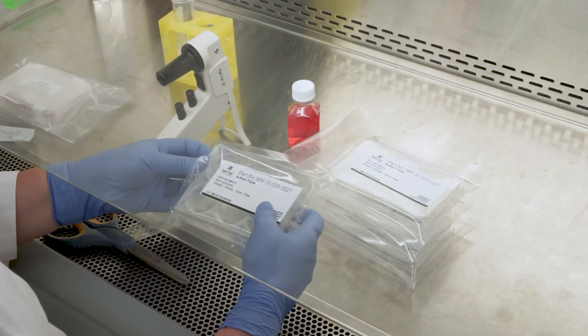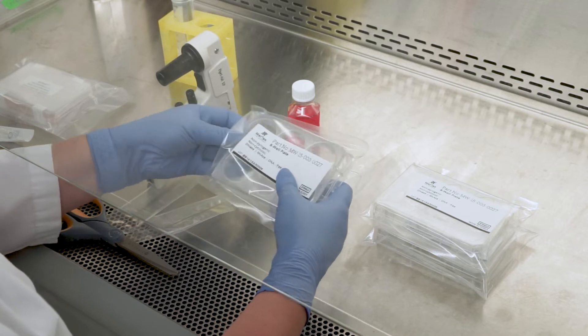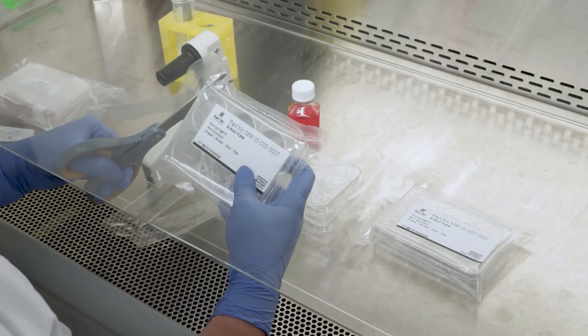Using sterile technique, place the assay medium and the four six-well plates in a tissue culture hood. Remove plastic wrapping from each of the six-well plates and label each plate accordingly, as you see fit.